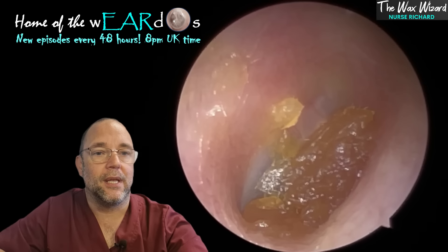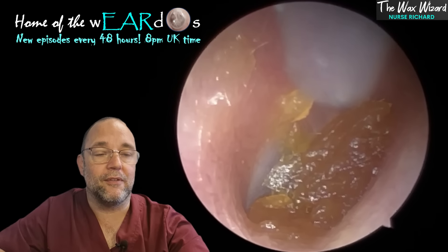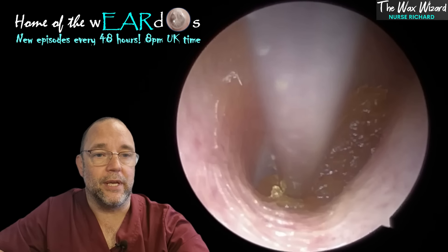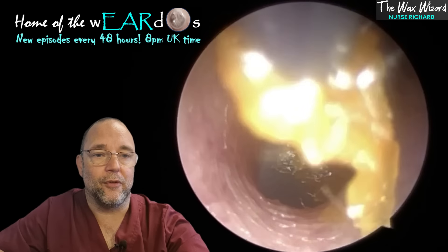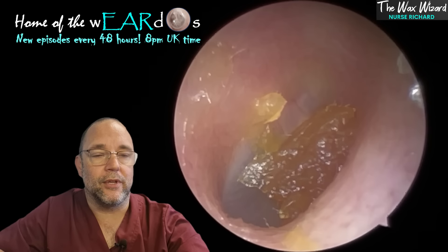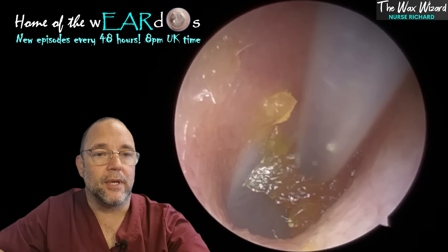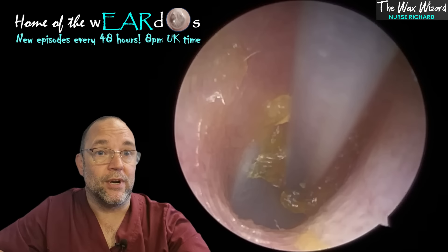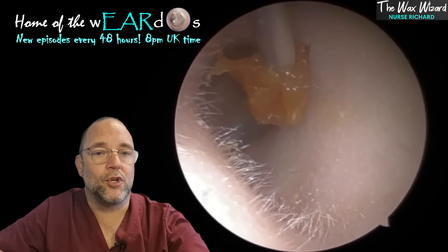When I'm doing this, I'm actually looking around the device we record with, using the naked eye, because it's not inside the ear at this point — it's outside it. I didn't get the forceps because I thought this was too soft and it would just cut through it, but as you can see the suction tube brought that out quite nicely. It's left this on the eardrum, very similar to the previous video, but thankfully not as big a quantity and certainly not as impacted. Unfortunately it just broke off there, so let's go right down on the eardrum and get that last piece.